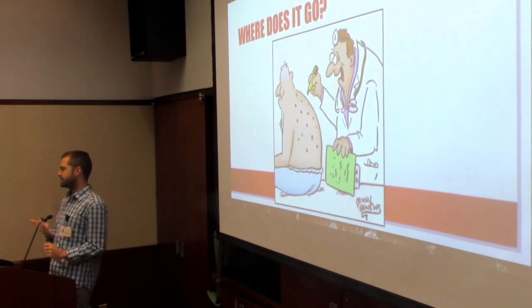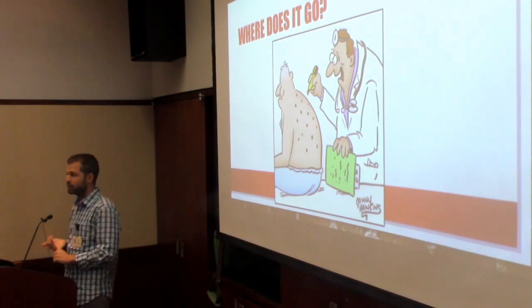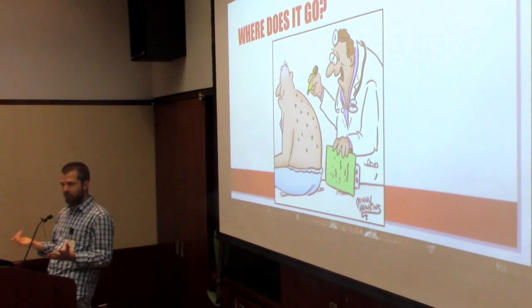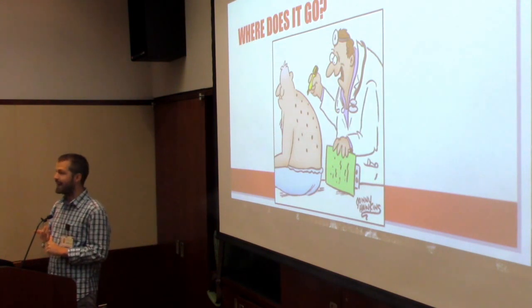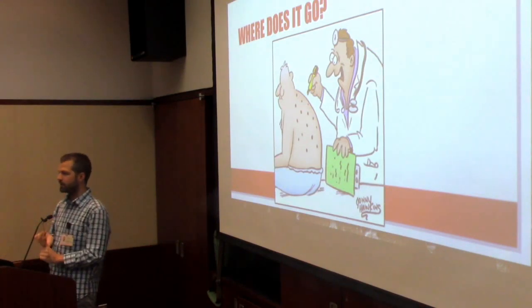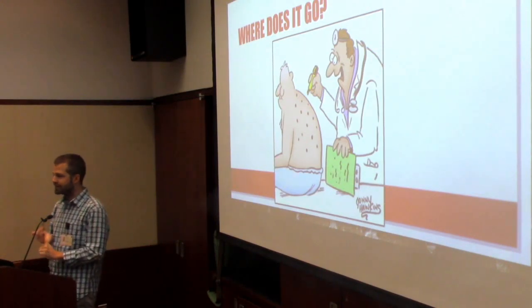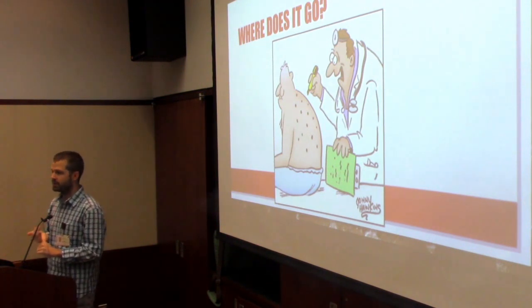Where are you going to put this? So, say for example you're putting in a central line. Not a billion options, but you got a few. It's important to think about things beyond just the anatomy of where an object's going to go. So if you're putting an ultrasound guided IV in the arm, you got to think about convenience. Can a nurse get to it? If a nurse can't get to your IV because it's tucked into their armpit and the person's morbidly obese, it's not going to help you in an emergency.